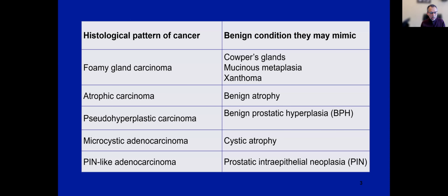So here is a summary of prostate cancer conditions which are known to mimic benign conditions if you are not aware about it and if you do not apply a systematic approach towards the diagnosis. We will cover some of these particular entities during this particular talk.